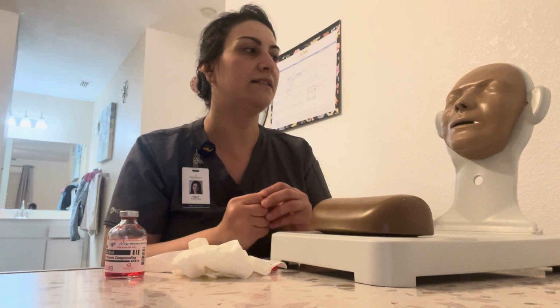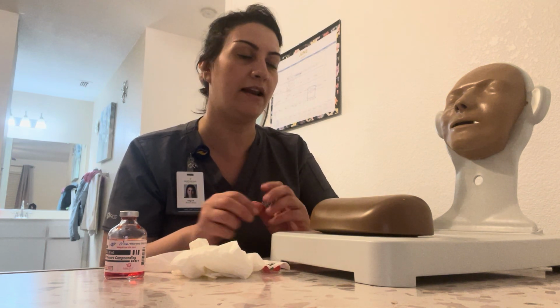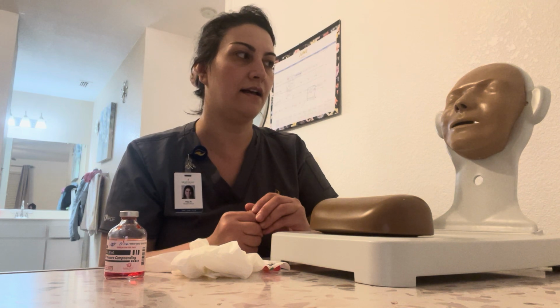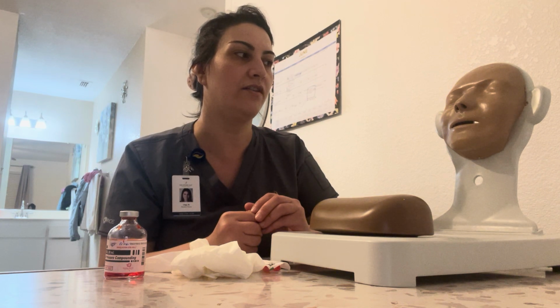All right, Mrs. Smith, so the reason why I'm here is your doctor has prescribed you an injection here. I have an injection ready for you. Your injection is called heparin. This is an anti-coagulant. Basically, it prevents blood clots. Most patients receive this if they're going under surgery or through an IV. In your case, you're going to be getting that because of your DVTs.